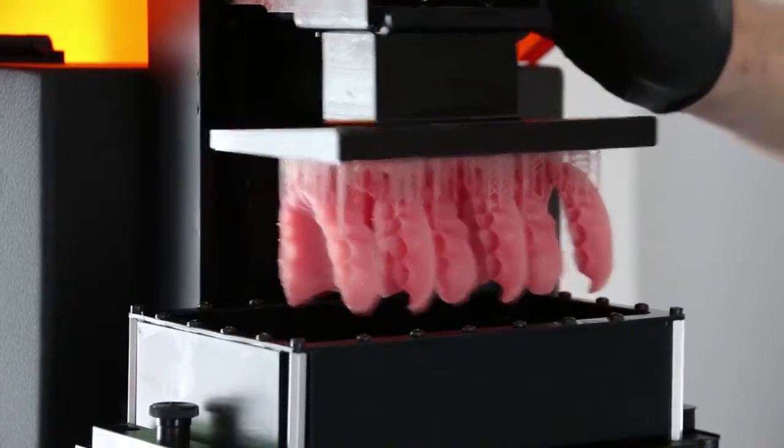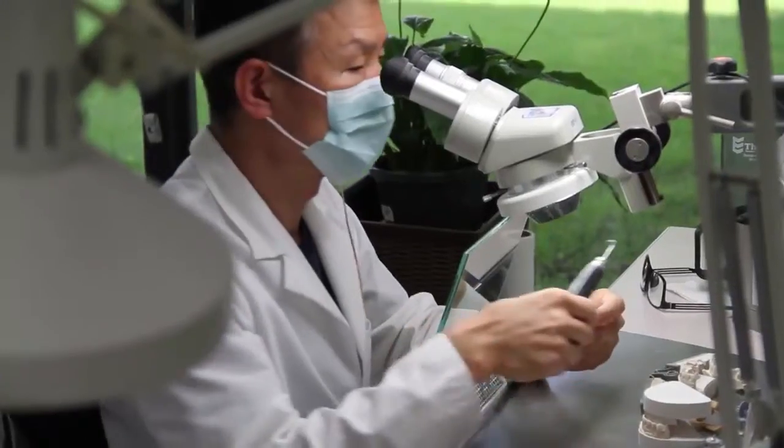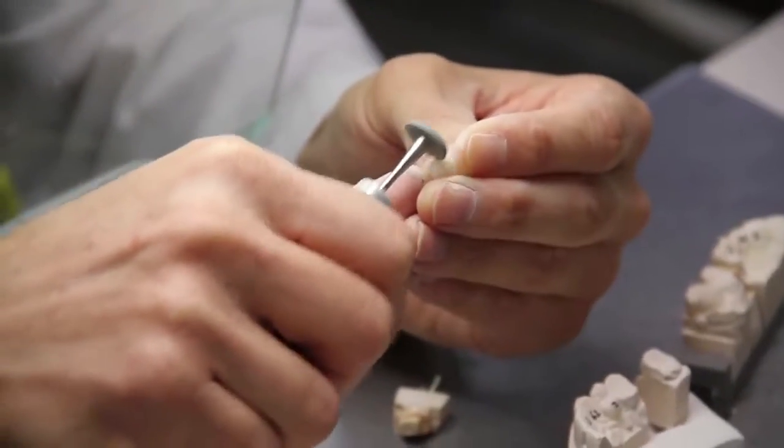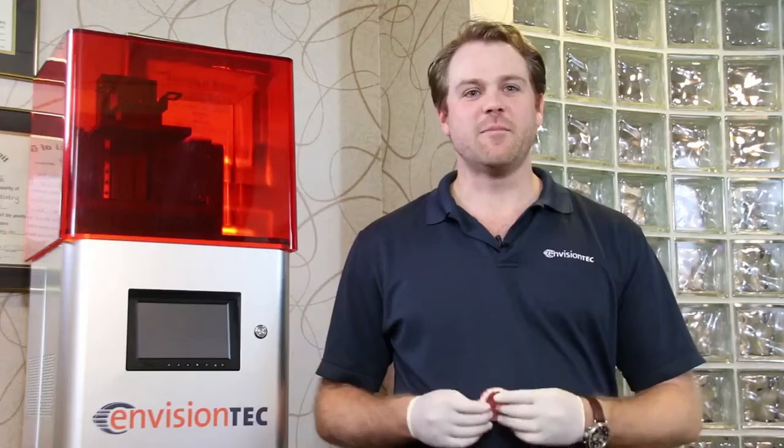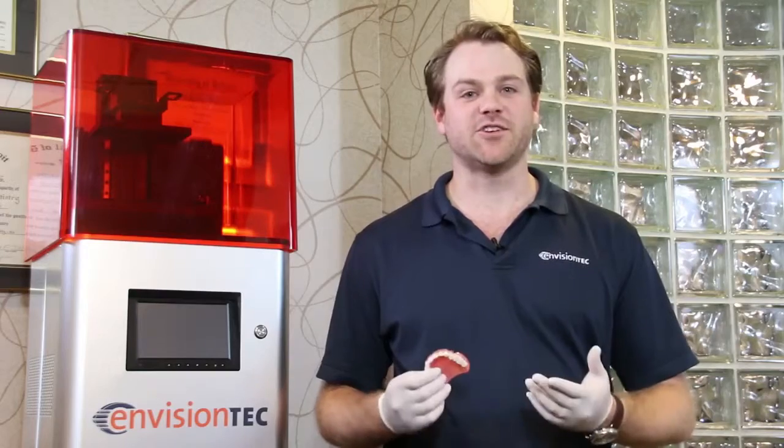The Vita can print 6 dentures in just under 3 hours, saving the denturist hours of time at the bench, not to mention how much overhead can be saved as well. Each denture base is costing between $4 and $6, making this a really cost-effective solution for providing dentures.